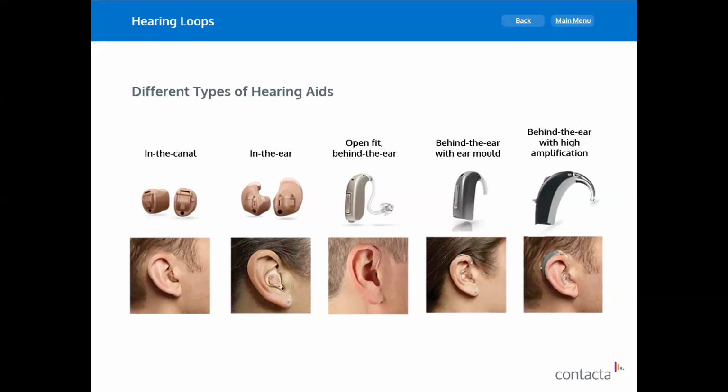The bigger the hearing aid is, the more space there is in the cabinet to put a bigger battery, a bigger amplifier, and other features. The smaller it is, the more hidden and discreet, and the more it goes totally in the ear, the space is very, very limited. The hearing aid manufacturers then start to take out components that are not necessary.